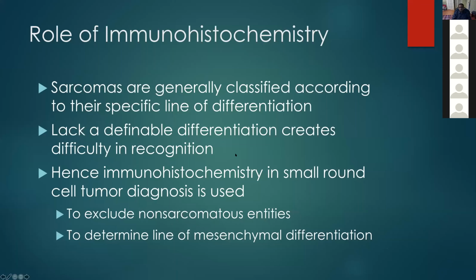And you might say, my institution is poor, or overall, I'm very familiar with how, in India, your hands are tied in terms of getting immunohistochemistry. It is getting better than the last 2 decades. It has steadily improved in getting access to immunohistochemistry. Reagents have become cheaper. Your technologists have become better in getting these stains done. Tissue stabilization has gotten better. Fixation has become better, etc., etc. Of course, machines have come in, and newer and better quality technology has entered the realm of pathology.